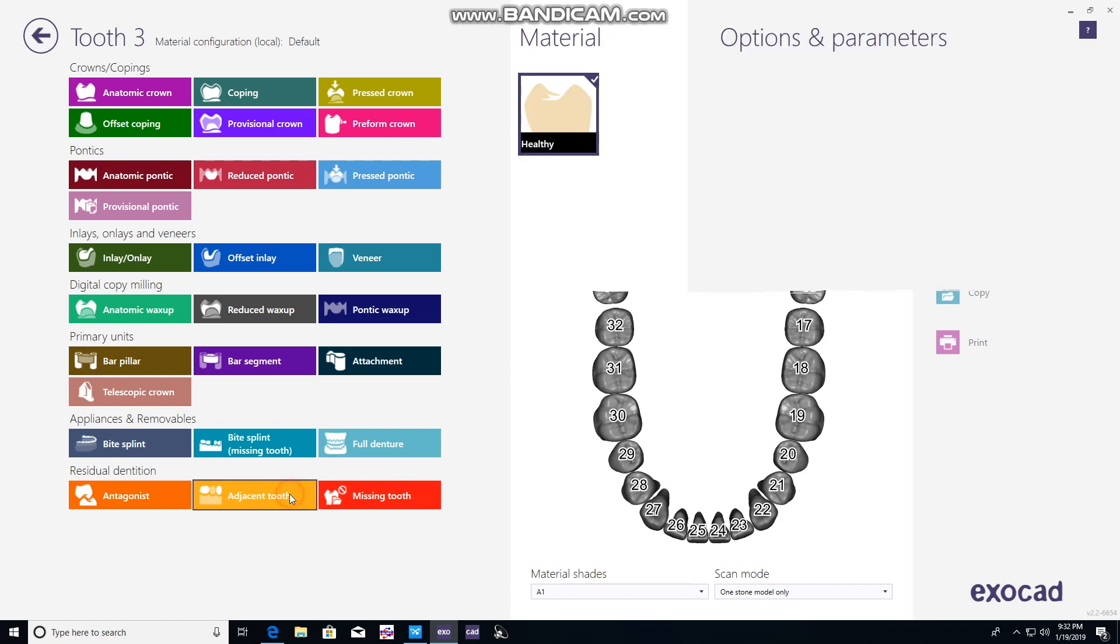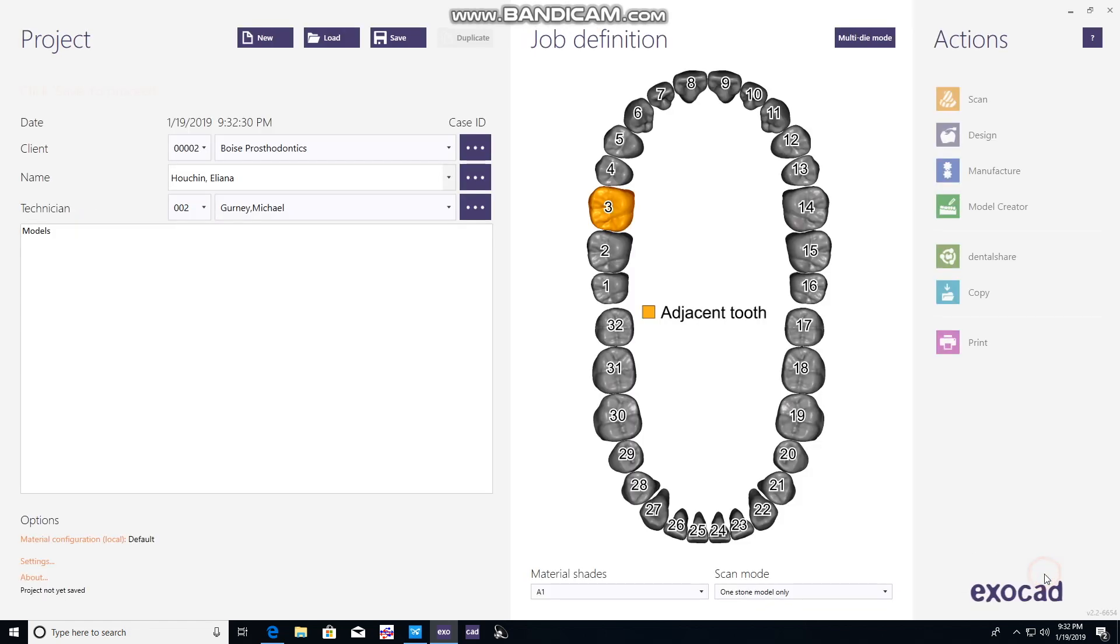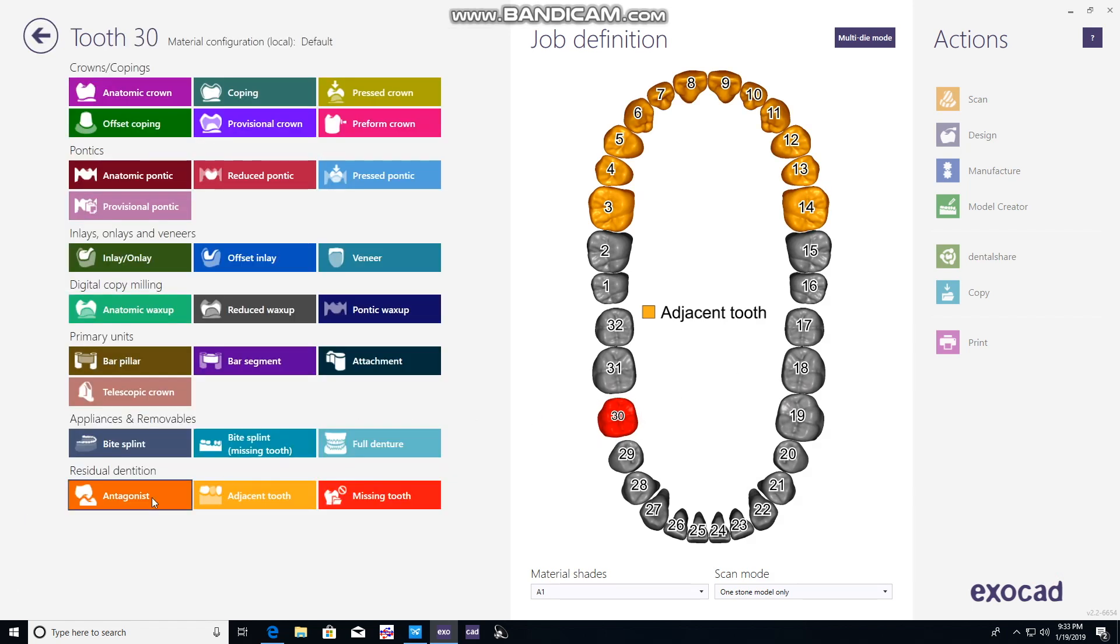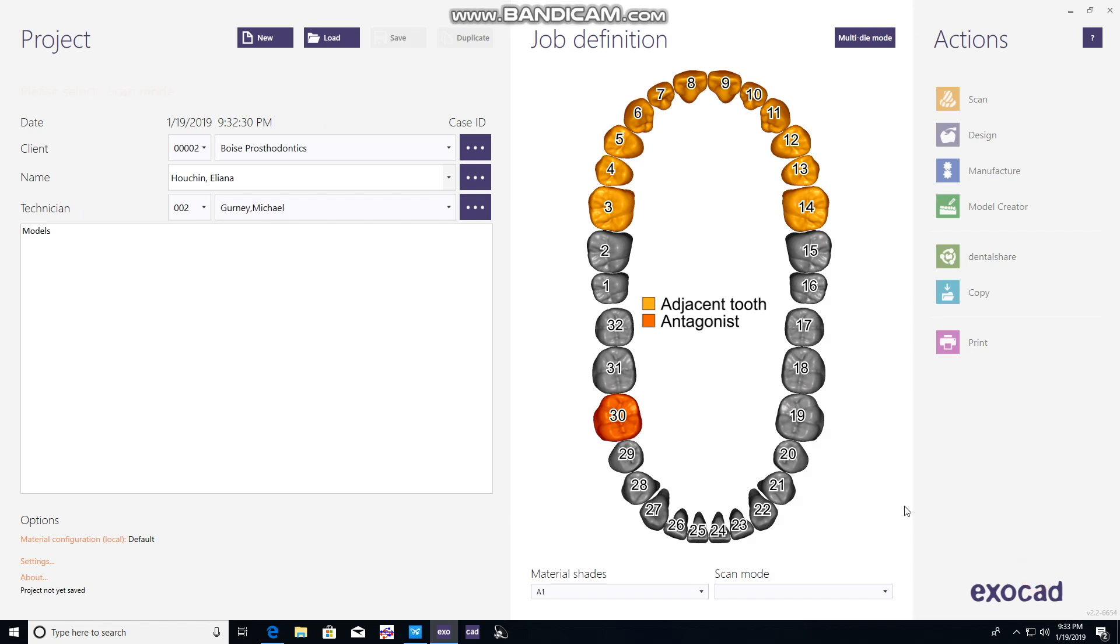We're making models. Click on a tooth and make it simple. Just click on an adjacent tooth, hold down shift, and click on another tooth to highlight all of them. For the antagonist, same thing - hold down shift and click on another tooth. We're ready to go.